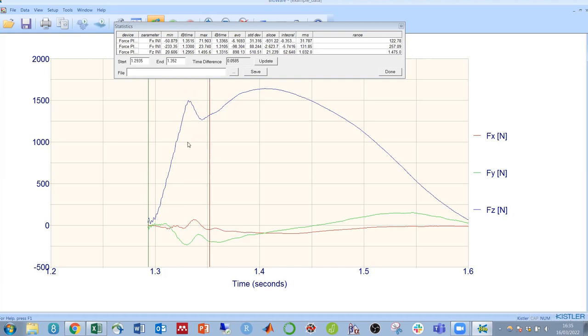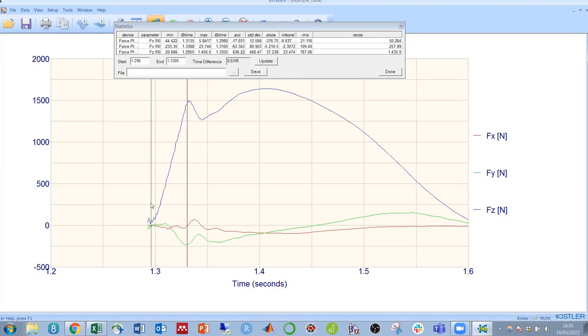If we wanted the initial rate of force development, then perhaps you could put your lines around the start and end of this initial increase in order to get the slope.